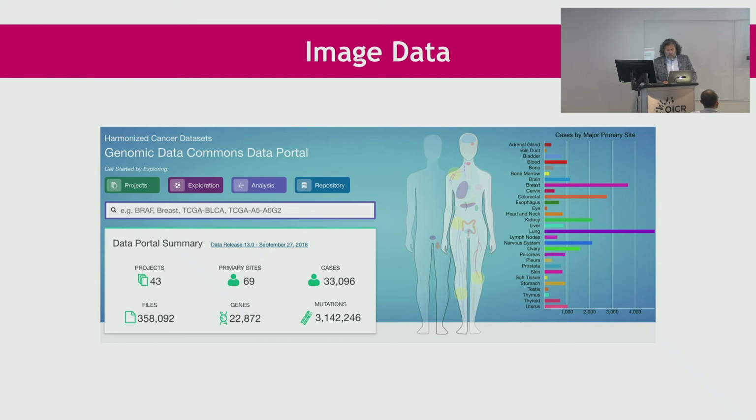But among others, the NCI, National Cancer Institute, the TCGA program, you have a large number of glass slides, digitized, with confirmed diagnosis, with pathology reports, with genetic information, if you like, so you can work with that. So there's a mixture of data. That's maybe the worst thing about it, or actually a good thing about it, that it's heterogeneous. It comes from different manufacturers, it's not from one scanner, so that makes it good to really work with it. So this is one source of data that we are using.